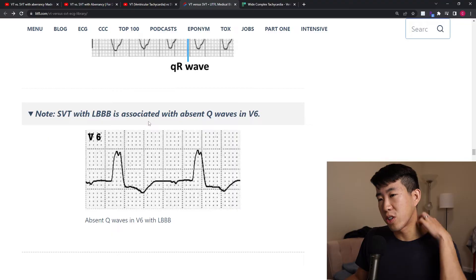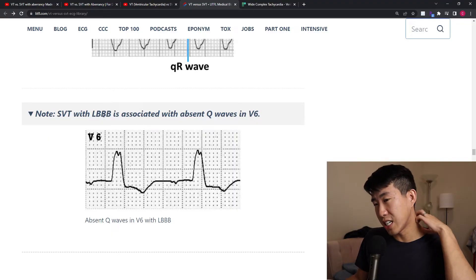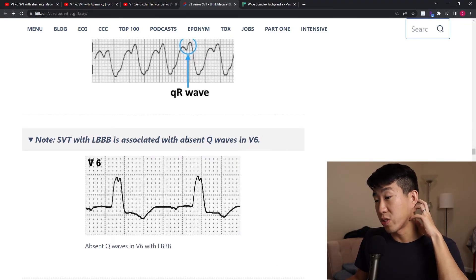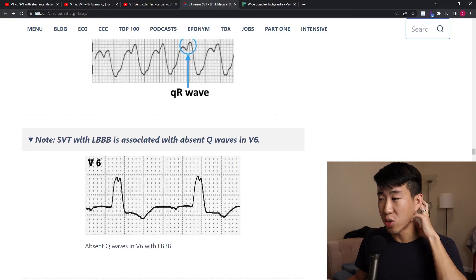In contrast, if you look at SVT with left bundle branch block, you will not see any Q waves in V6. The best way to practice this is to go through actual examples, and this website provides some cases to work through.